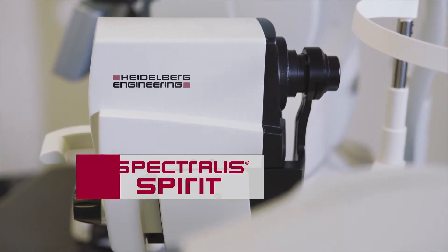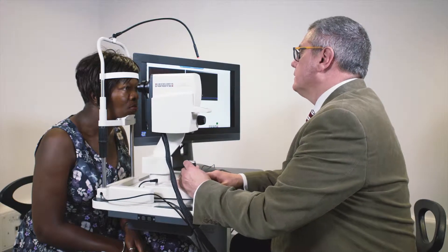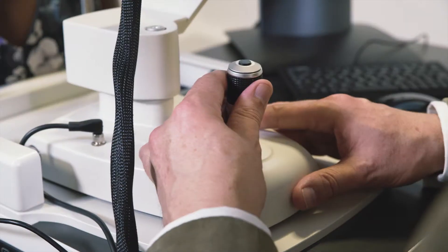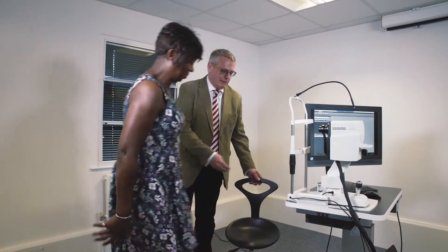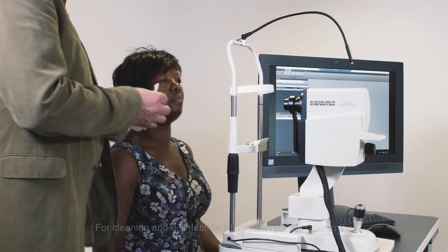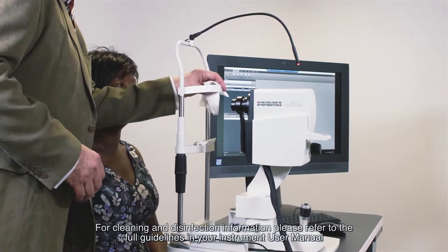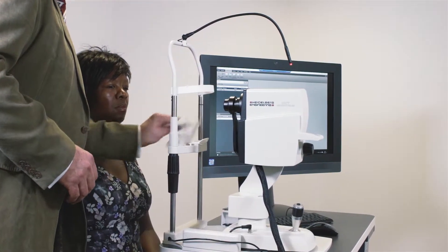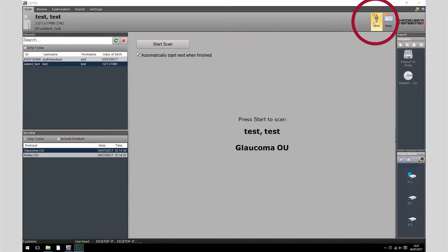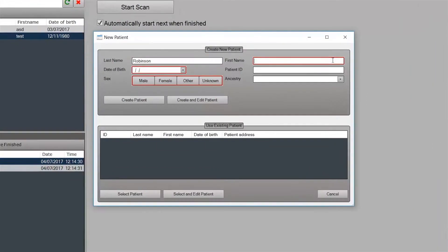This is a short instructional video for Spirit OCT users on how to acquire retina and glaucoma scans. The patient should be seated at the Spirit OCT instrument and the headrest cleaned in accordance with local infection control policy. The patient information should be entered into the Heidelberg Eye Explorer software.